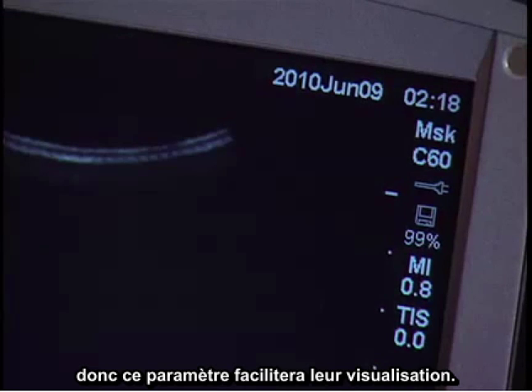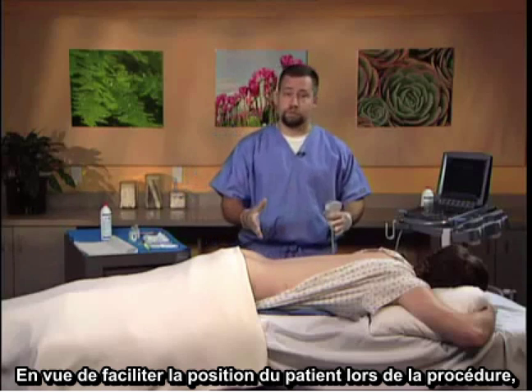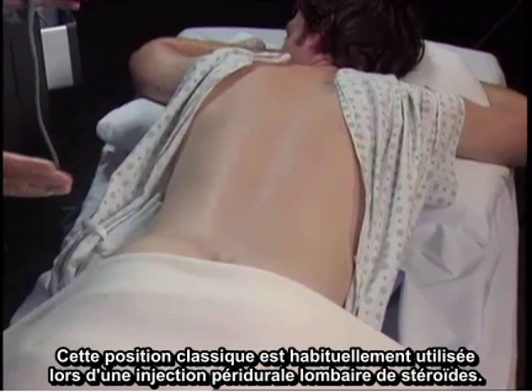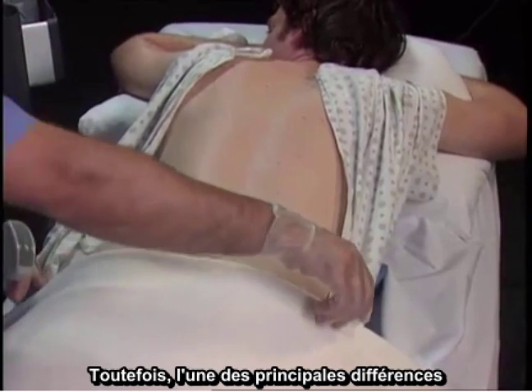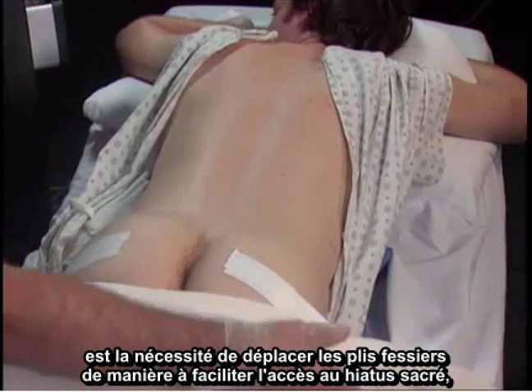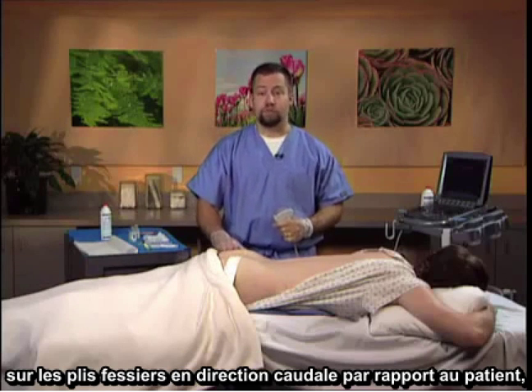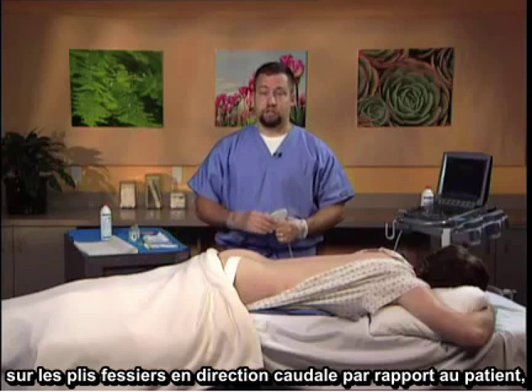In order to facilitate placement of the patient for the procedure, it is necessary to have the patient in the prone position as seen here. This is a typical position that would normally be used for a lumbar epidural steroid approach. One key difference, however, is the need to move the gluteal folds so that access to the sacral hiatus, which is the key target, is facilitated. You can see that the gluteal folds have been taped down and away in a caudal fashion to the patient.